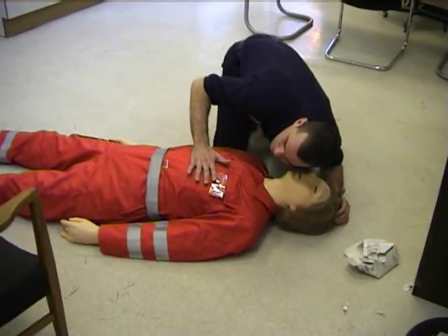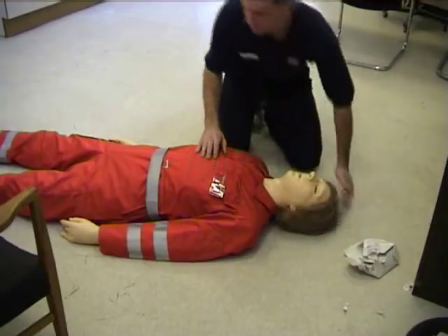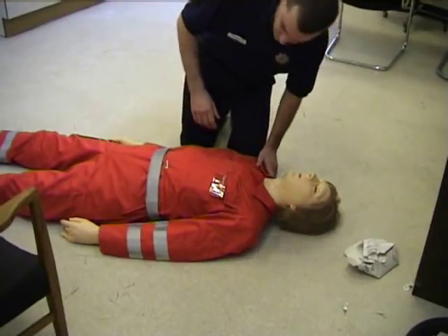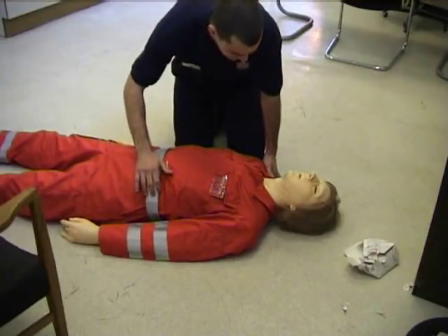It's breathing. Alright. I'm going to put the patient in the recovery position. Ok, just calm down then. Just think of that logically. Carry on with what you do, just calm down.